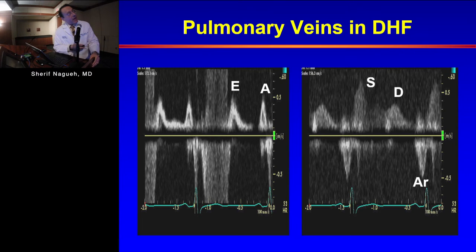The one thing that catches your attention is the mitral A velocity. It's a very short duration, but if you compare it to the atrial reversal velocity, this is a very large wave, peak value 50 centimeters per second, and duration way exceeds that of mitral inflow.